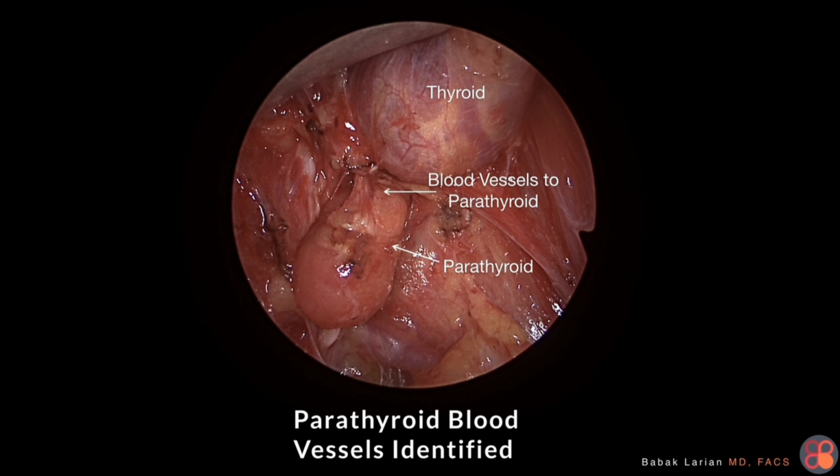And now the parathyroid is released except at its blood vessels that are coming to feed it, right? And the nerve, I still see the nerve here behind the parathyroid now, because now I've brought the parathyroid, the superior parathyroid that used to be deep to the nerve, now I've brought it forward. I've exposed the blood vessels feeding it, right?